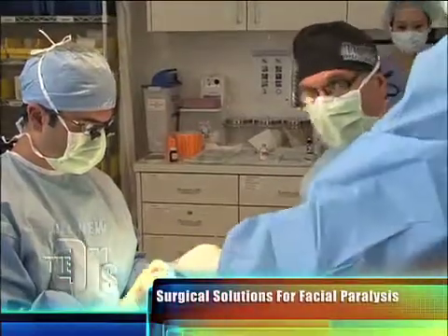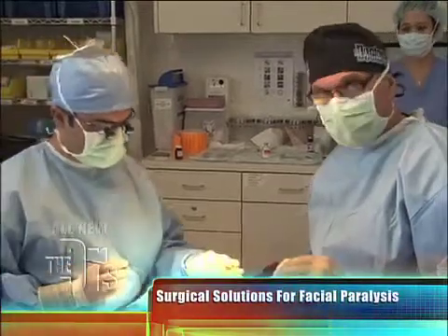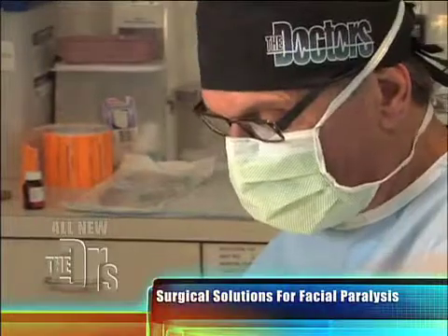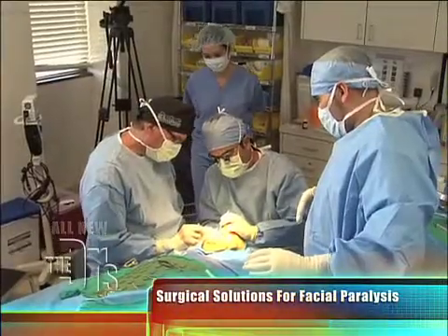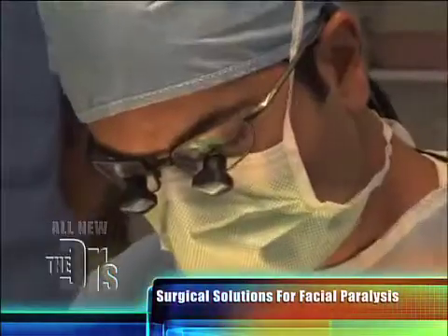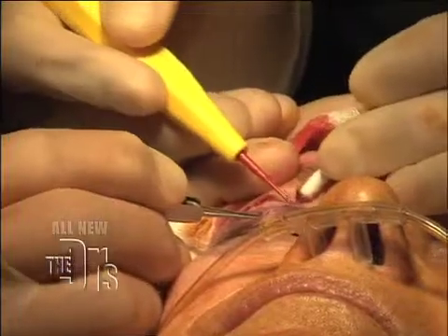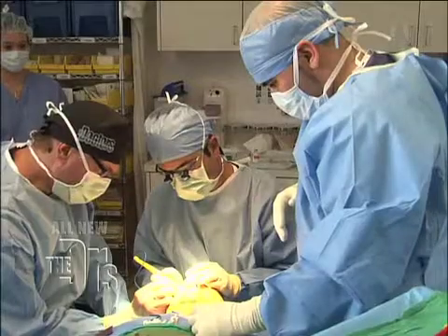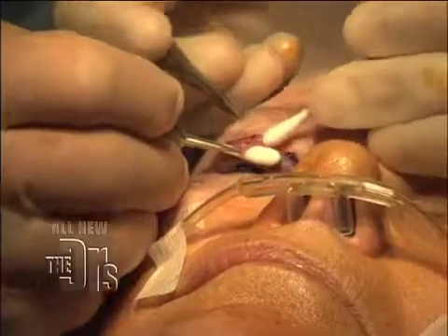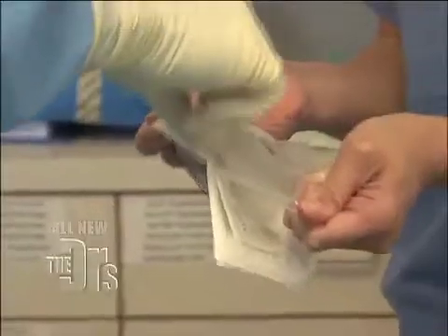In this case, Dr. Parsa is doing the bulk of this surgery but he needed an extra set of hands here today. Very often on these complex eyelid reconstructions we work together. Right now what we're doing is creating that pocket so we can put in that gold weight and at the same time release all the scar tissue — and there's lots of it. Let's have the gold weight.